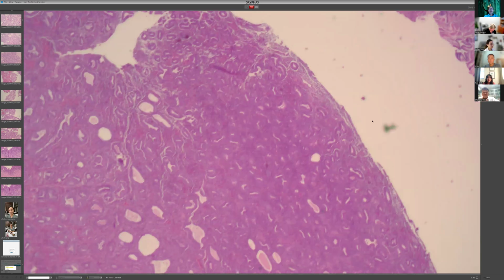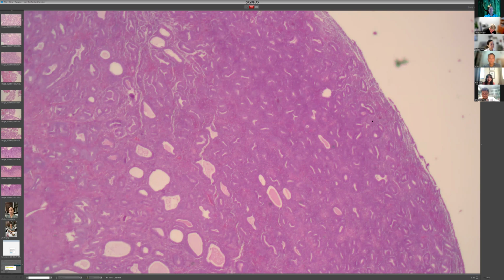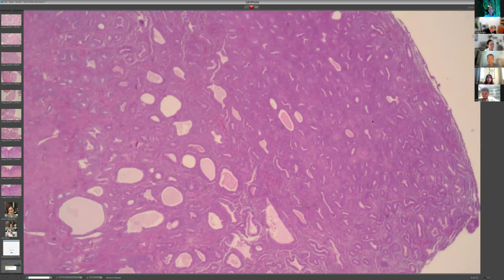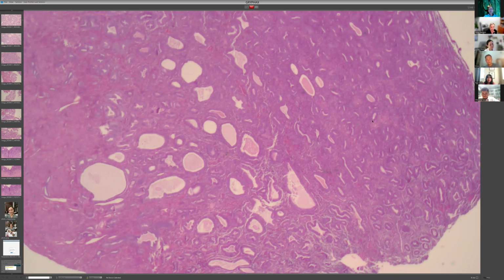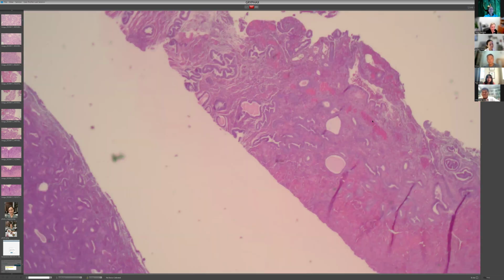And of course that's helpful. You're helped if you've got an area of good normal or more normal appearing gland to stroma ratio to compare it with. Sometimes you have that, but sometimes you don't, and then it's a little bit harder. Right.